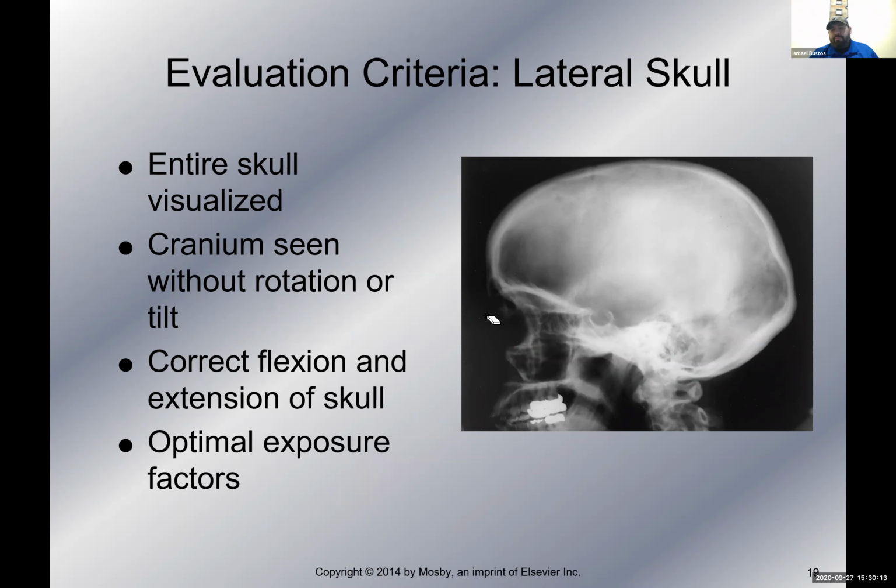All right, and of course, optimal exposure factors, sharp lines, bony trabecular markings, okay? So make sure you don't see any blurry lines.